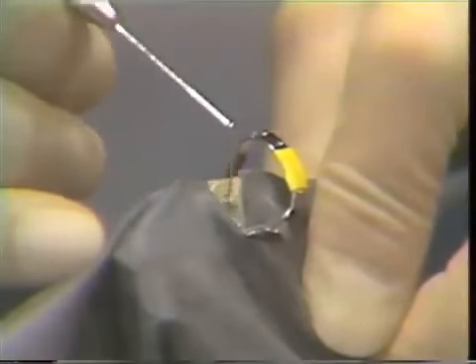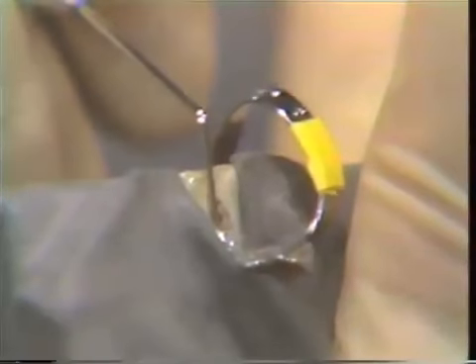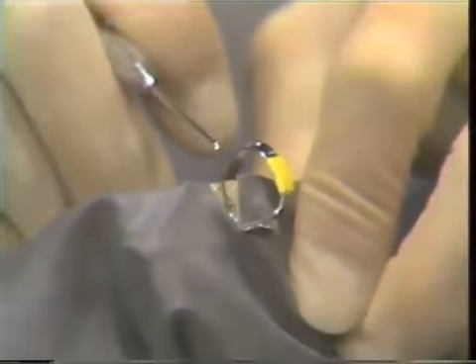Come in heading towards the labial and go right down into the pulp canal. Come in from the lingual and go right on down. Feel for 2 canals and only accept that you have one when you're sure that you can't feel a second. As you can see in the cross-section diagram, you can come in through the access preparation from the lingual heading towards the buccal. Go all the way down and the wall will guide you into a canal.